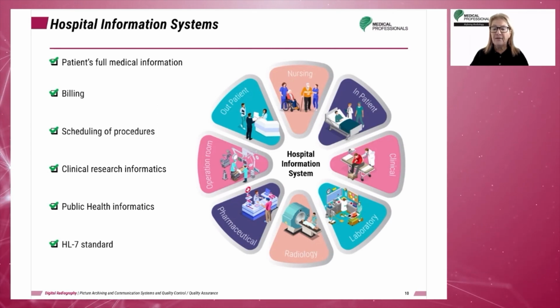They accredited the HL7 standards developing organization. They are used in most healthcare applications, including the communication between HIS, RIS, and other medical devices.